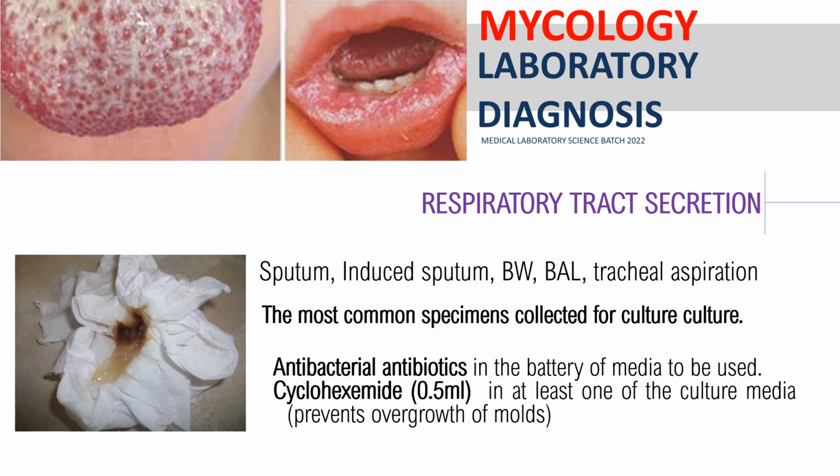I want also to emphasize with the picture class, kasi yung sample nakalagay lang sa tissue. So, the proper collection for your sputum and respiratory tract secretion should be a screw cap wide mouth bottle class. Either glass or plastic, okay siya. Basta wide mouth, and then properly labeled. Alam nyo naman yan sa class.